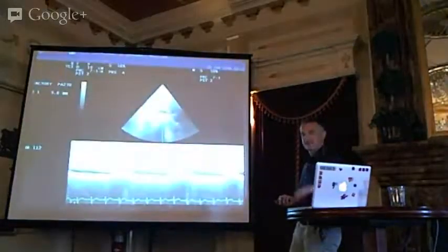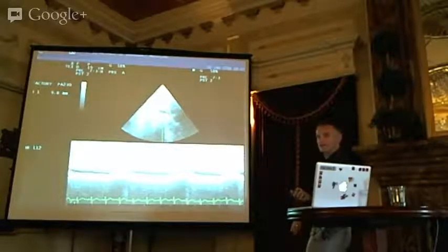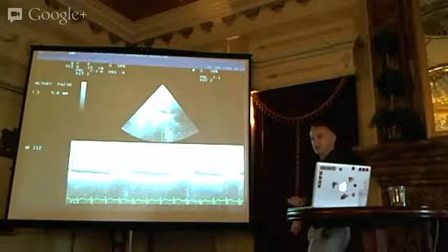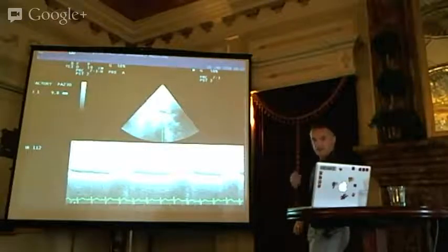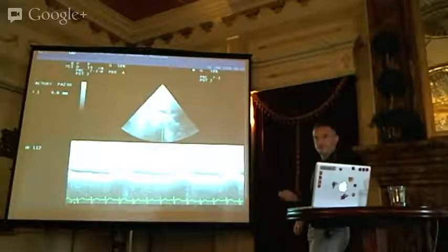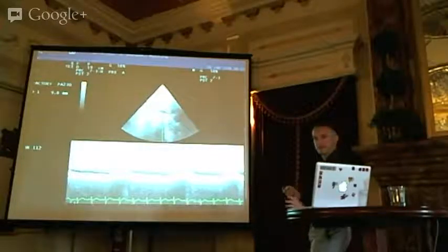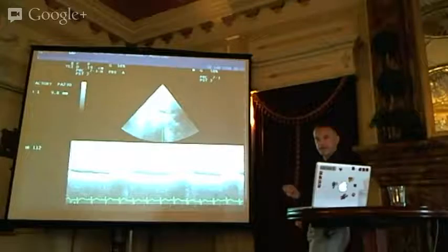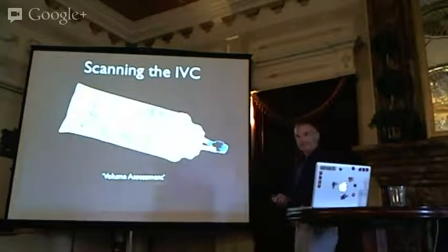We look at this IVC, this is time-lapse. So it's really skinny and it completely collapses every time he breathes in. I thought that was helpful. I thought that was a sign that he was probably still hypovolemic despite that fluid. Of course, we were rewarming at the same time, so probably making space as we go. So we gave him some more fluid and more fluid and more fluid. In fact, when we put a central line in, the CVP was 1, so this was a reflection of the CVP. We were able to comfortably give him some more fluid to sustain him. And he died. So, let's talk about scanning the IVC.